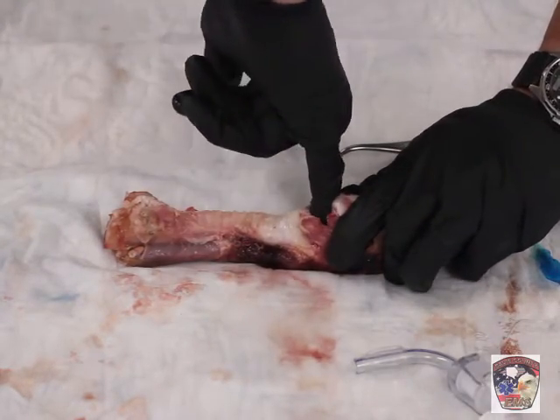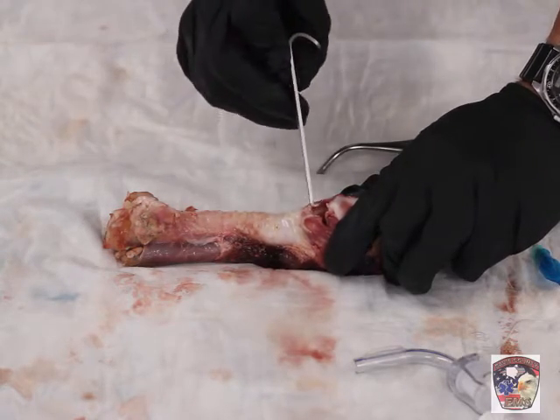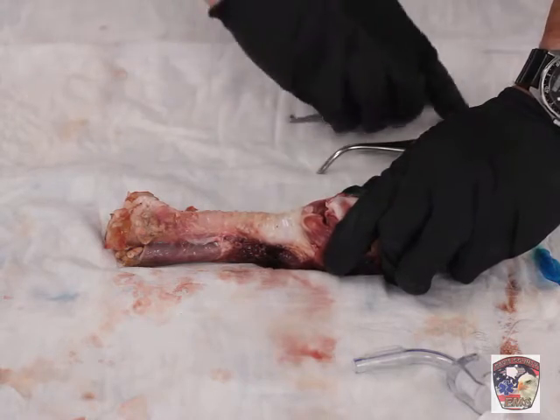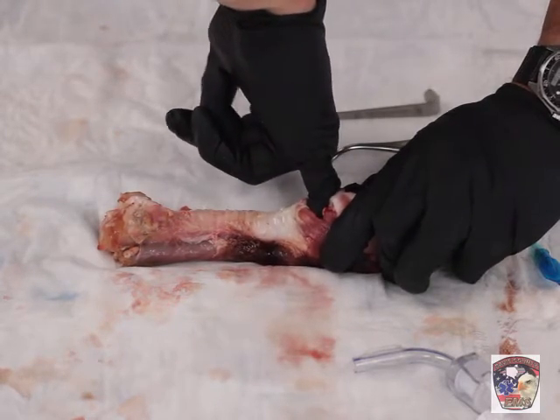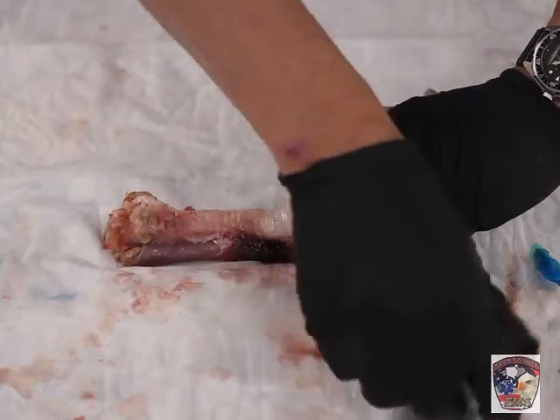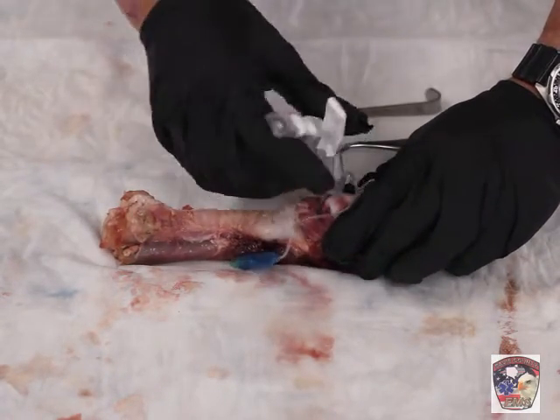Right place. I can find the lumen of the trachea, or I can take a tracheal hook and grab the trachea. Probably the preferred method is to take the index finger — here I'm going to use my small finger — and make sure I'm in the lumen of the trachea. I'll put my finger there as a placeholder and then I'll insert the airway.